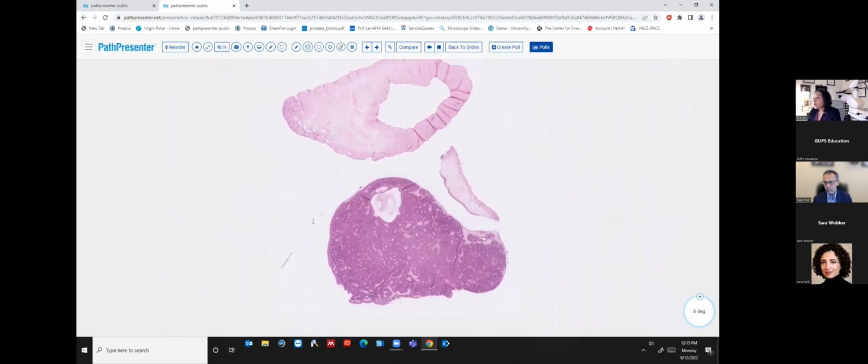Now, this is an entirely excised lesion, and the base here was sitting on a resection of the base of this lesion. So you can see that while it is not continuous, there is a distinct line which separates the outline of this lesion, and there is no proliferation seen in the tissue that this lesion was sitting on. So a very well circumscribed proliferation.